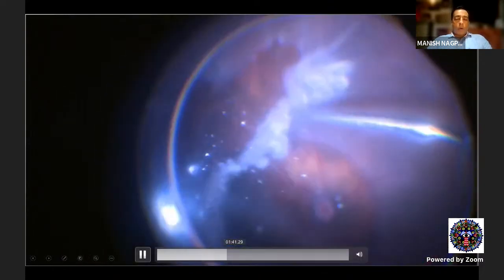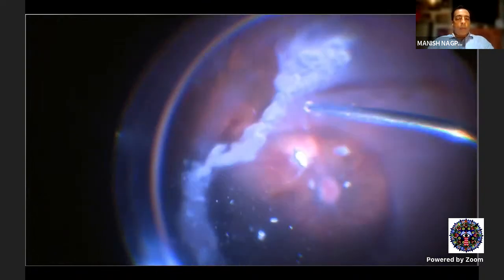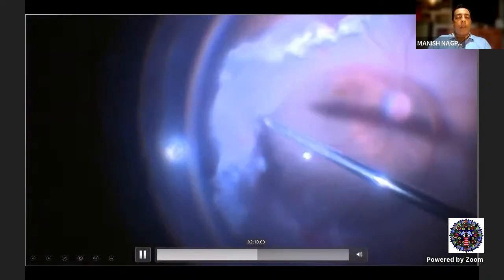Make sure for retinectomies, the best thing is to have a good PFCL, which is stabilizing the posterior pole, because at times it may bleed, and the PFCL helps you keep the posterior pole stable. Also, if a bleed happens, it does not reach the macula right away. It gives you a lot of time in these cases.